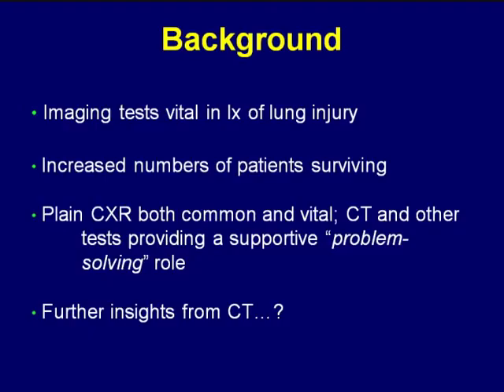Okay, so in these next 20 minutes, I'm going to talk to you about lung injury. And it is a fact that as radiologists, we do contribute to the management of patients with our imaging tests who have lung injury. With the skill of the anaesthetists and the clinicians who look after these patients, an increasing number of patients are certainly surviving this acute phase of abnormality.